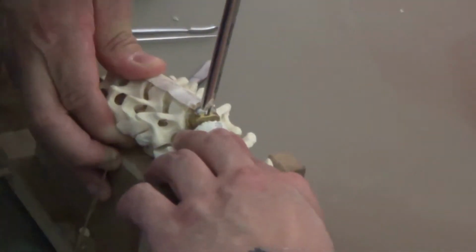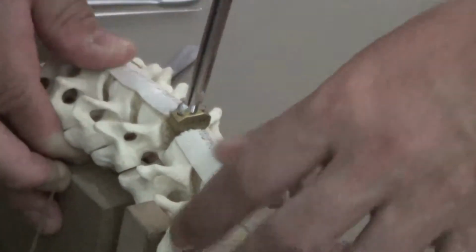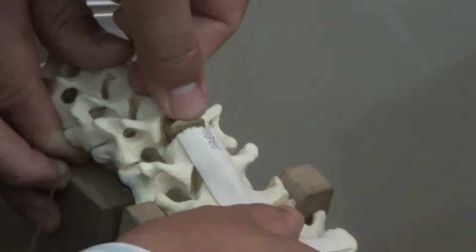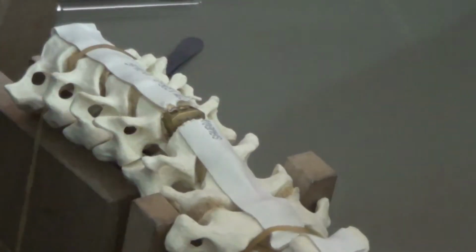So the patient's body weight compresses, so remove it. This is trial. You can see the X-ray easily without disruption. But if you use a sandbag, it is not so good.